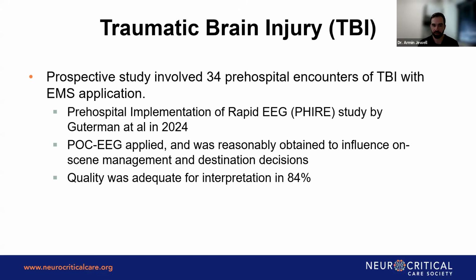And if there was a suspicion of a TBI, their study asked them to place the point of care EEG and decide, based on the severity of the point of care EEG data, what to do with the patient. Is it needed to escalate to a higher level of care or a lower level of care? And it made some difference on decisions for where they went.